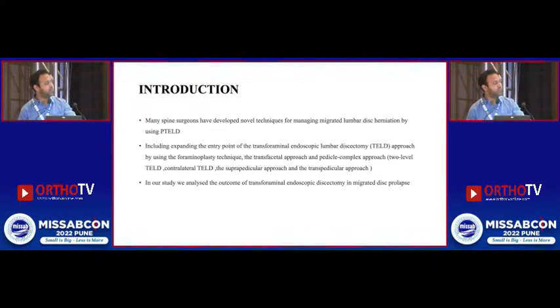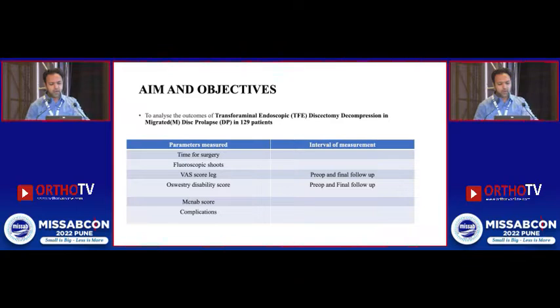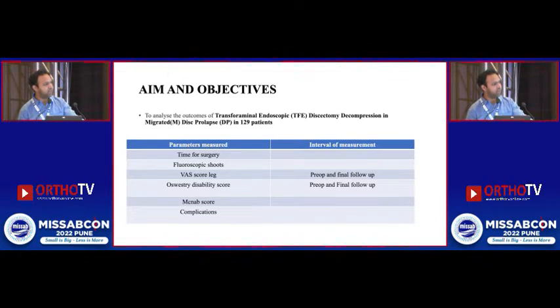But now the era has changed, and many spine surgeons have developed various new techniques like foraminoplasty, the transfacetal approaches, and the pedicle complex approaches. The aim of my study is to analyze the outcome of transforaminal endoscopic discectomy decompression in migrated disc prolapse in 129 patients.